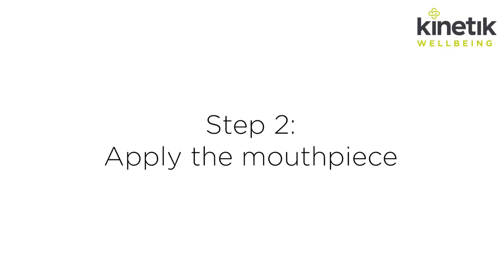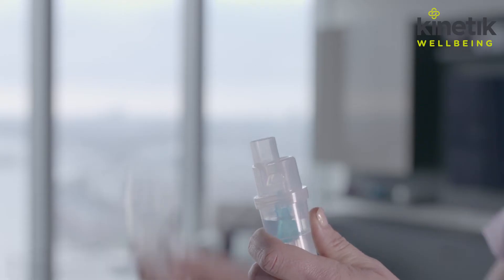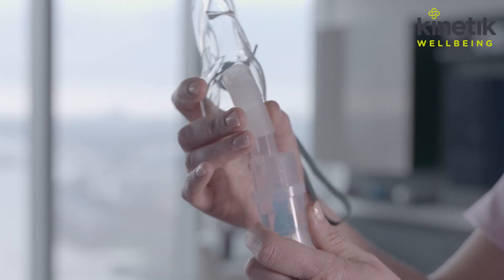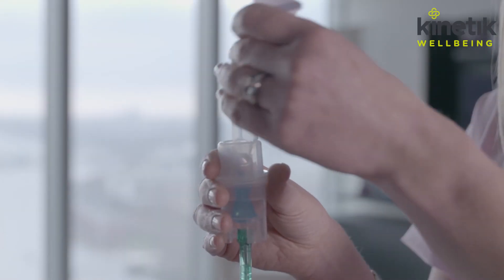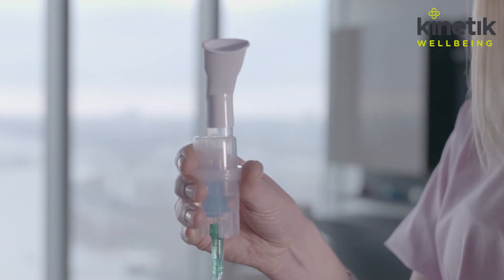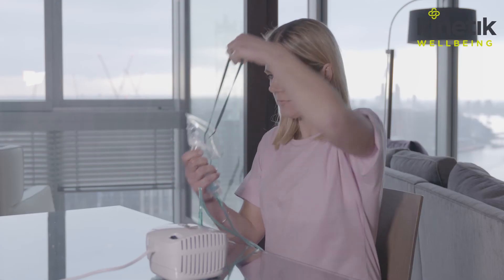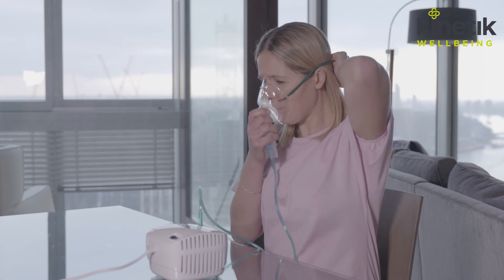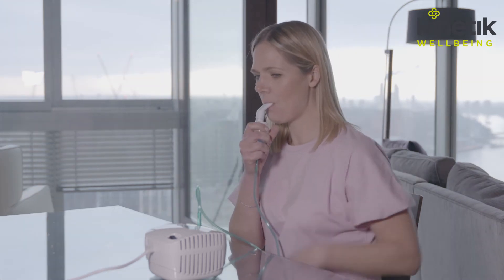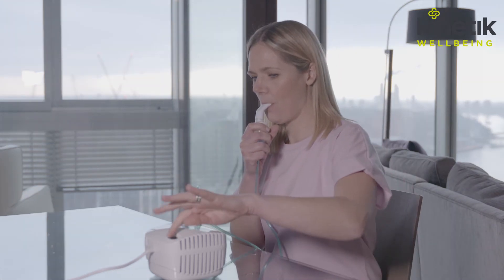Step 2: Apply the mouthpiece. Attach the tube to either the mask or the mouthpiece — this is dependent on your preference. If you are using the mask, ensure this is tight over the mouth. If you are using the mouthpiece, place between the teeth and close your lips around it.